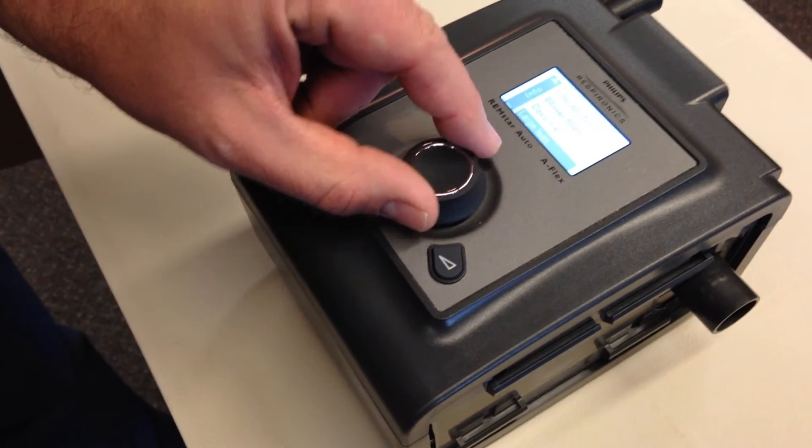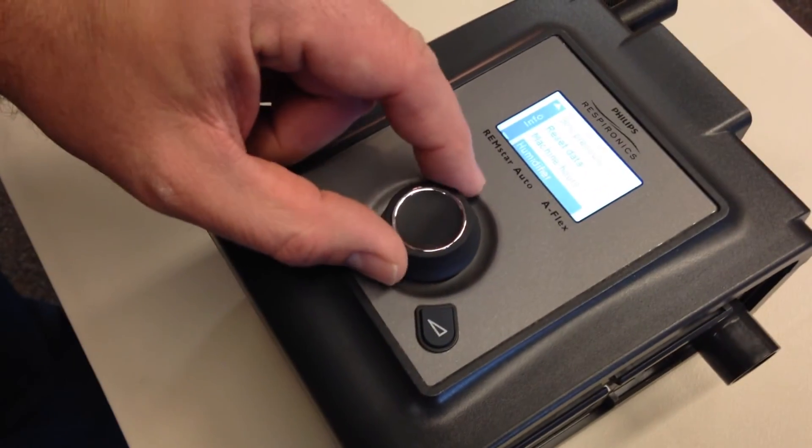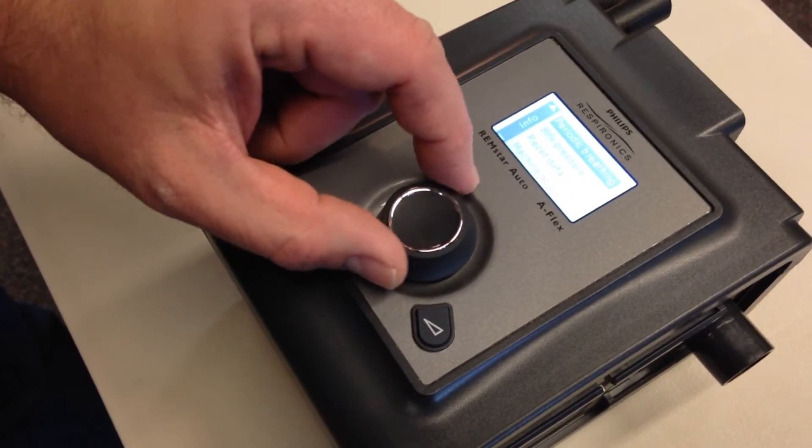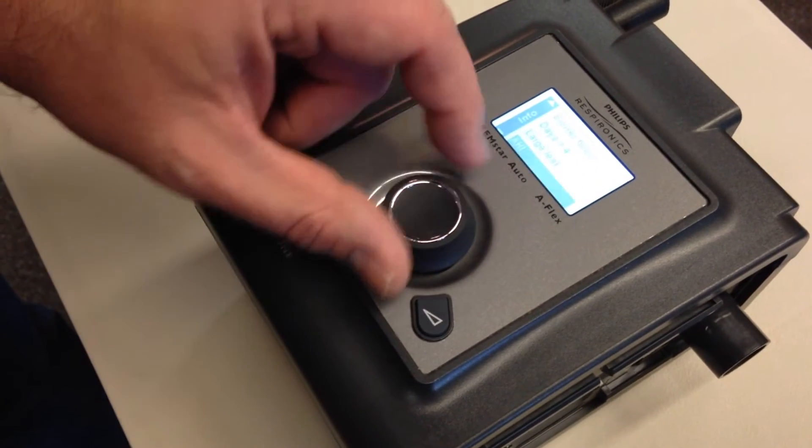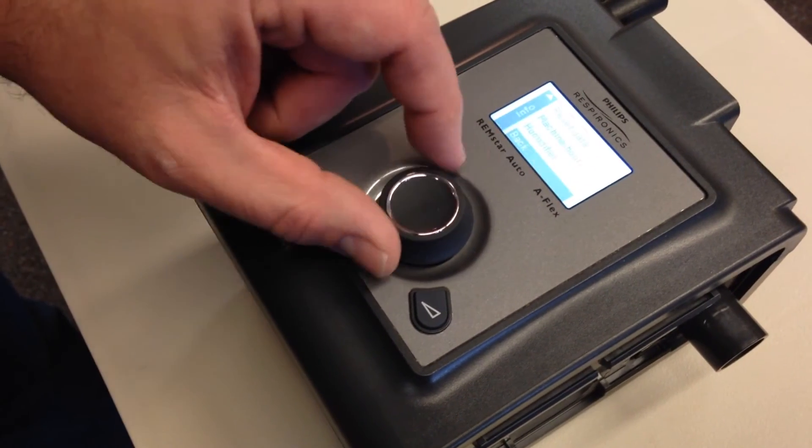Then you're going to need to scroll down to machine hours. Now again, it's not blower hours because those are also listed in this screen. You need to go to machine hours.